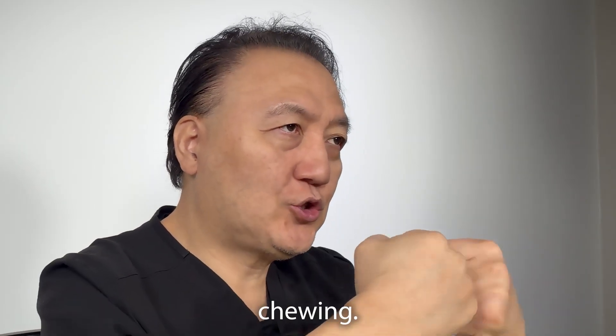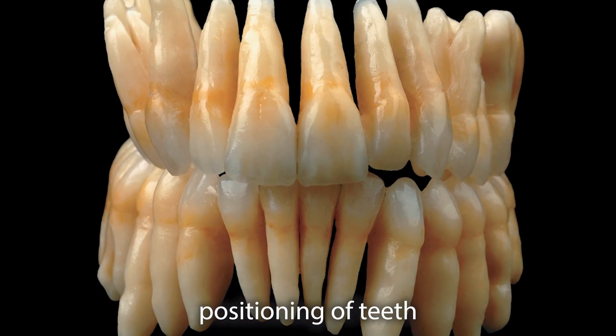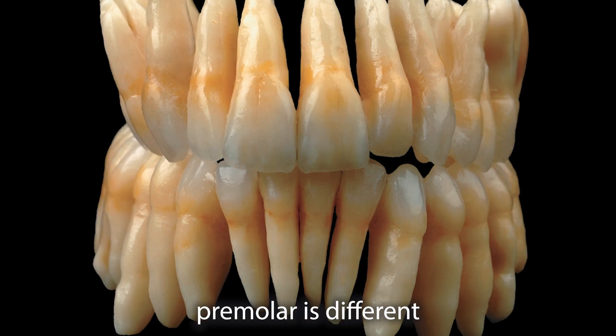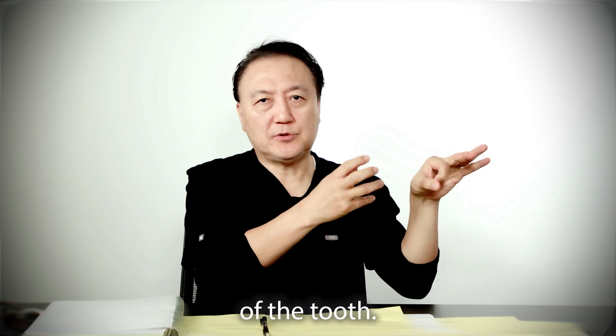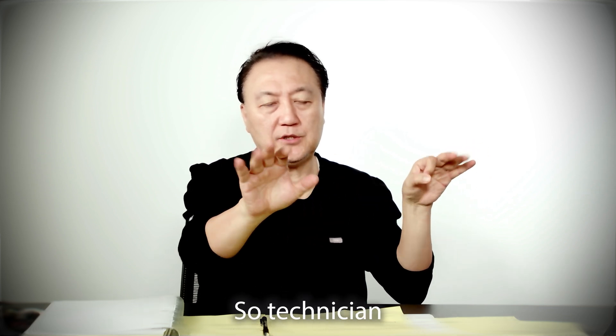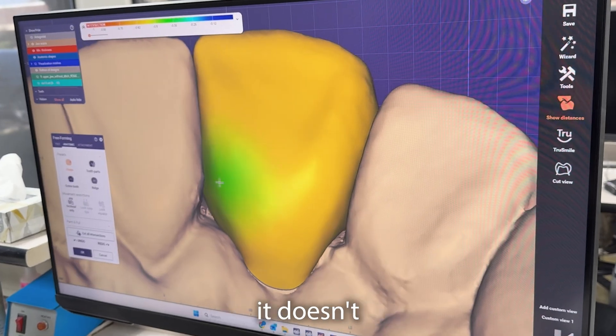Function means occlusion — chewing. Different tooth positions require different approaches: canine is different, premolar is different, molar is different, upper molar is different, lower molar is different. We know the size of the tooth. The software doesn't matter — Three Shape or Exocad, it doesn't matter. What matters is that the technician has to sit down and think.